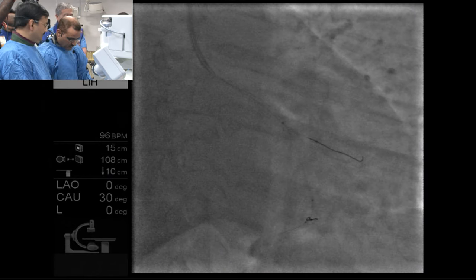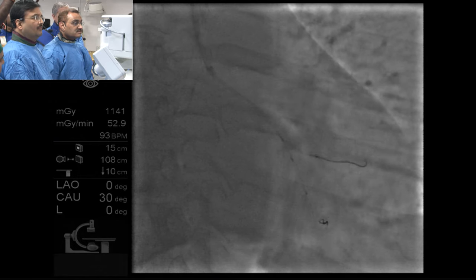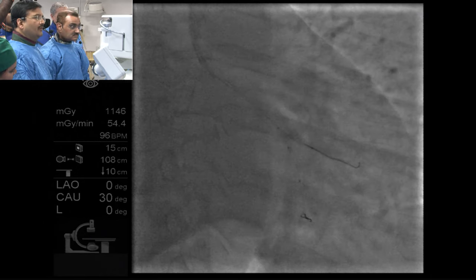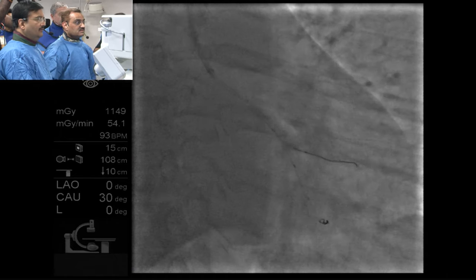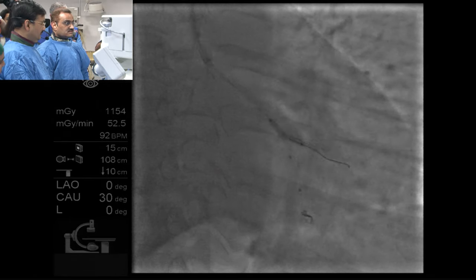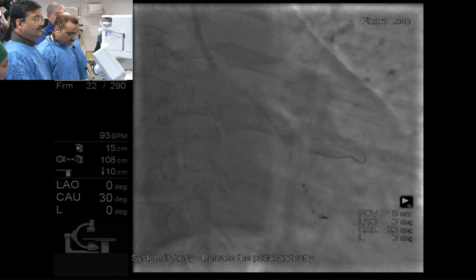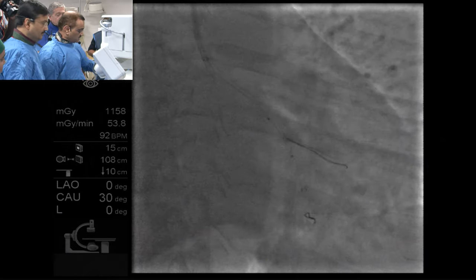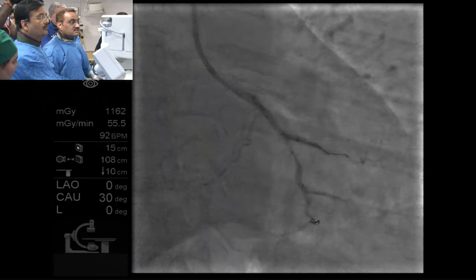That thing isn't too far. It's distal. Can you watch the distal wire? Yep. Okay, now you can go up there. Then we remove the whole assembly. The guide was deep throated. Okay, go ahead. Just you have to crack it. That's it, down. Balloon ruptured, I think. Just test it, make sure we see a little bit. Hold on one second. Okay. Good.